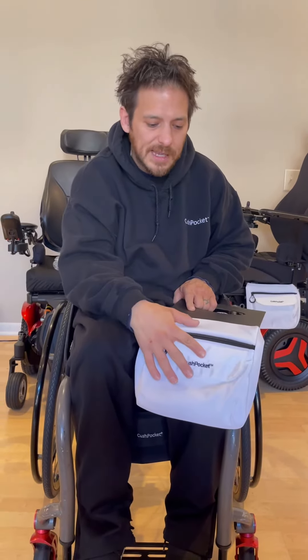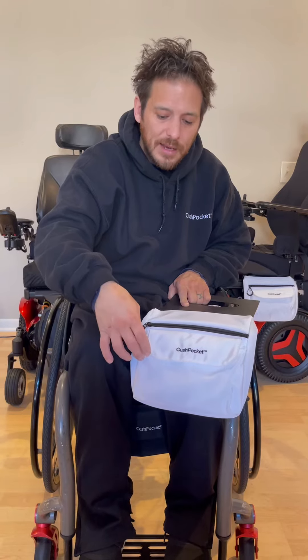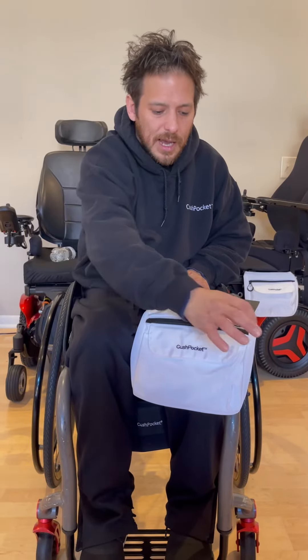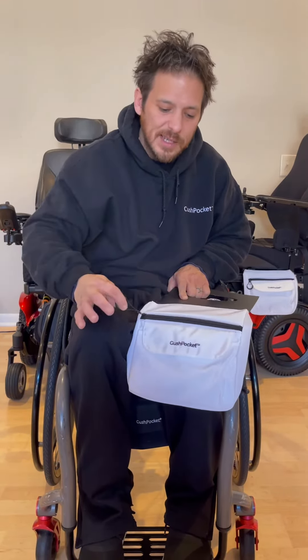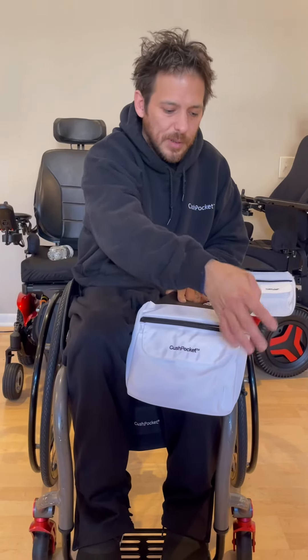The outside storage compartment has a really nice magnetic flap — people love that. The big bag has a nice o-ring style zipper that opens and closes easily every time, and people really love that too.